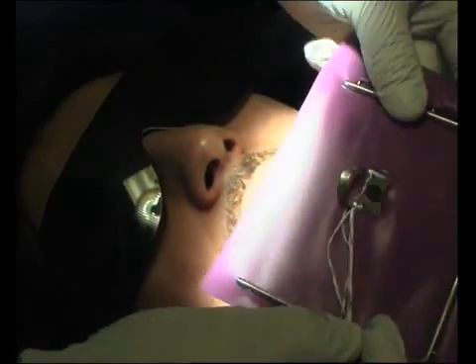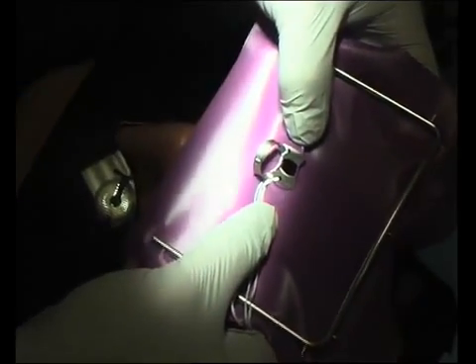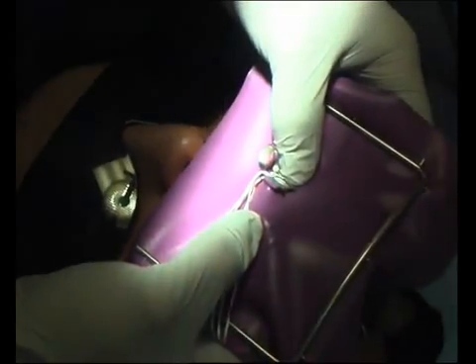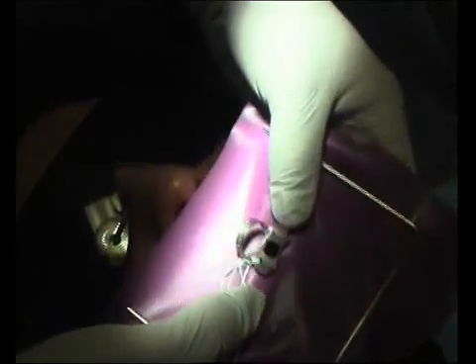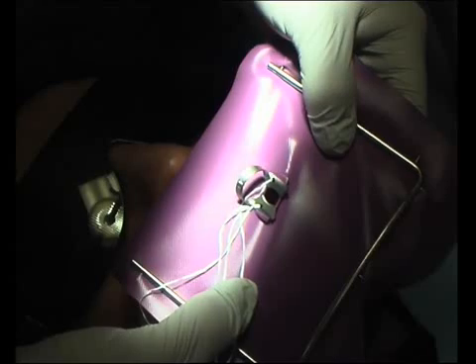So what I've done now is I've put the rubber dam behind the wings on the clamp. You've stretched that hole around it. So that's on there like that — you've stretched the rubber dam over the edges of the clamp.